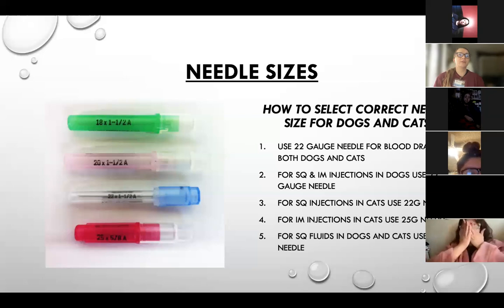Sometimes these injectable solutions like penicillin are extremely thick. So you actually have to have at least a size 20 just to pull it out of the bottle. So some of them we have to use larger, but we like to use smaller if we can.